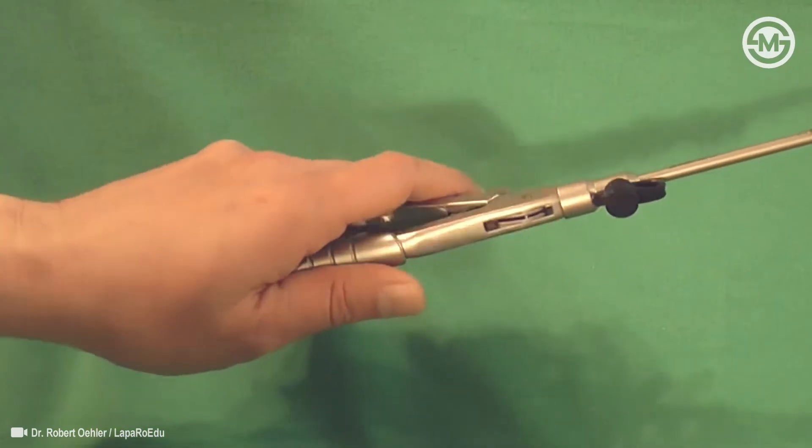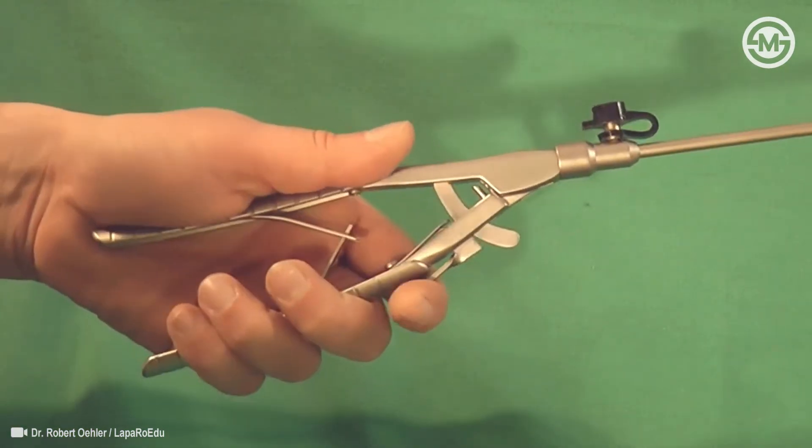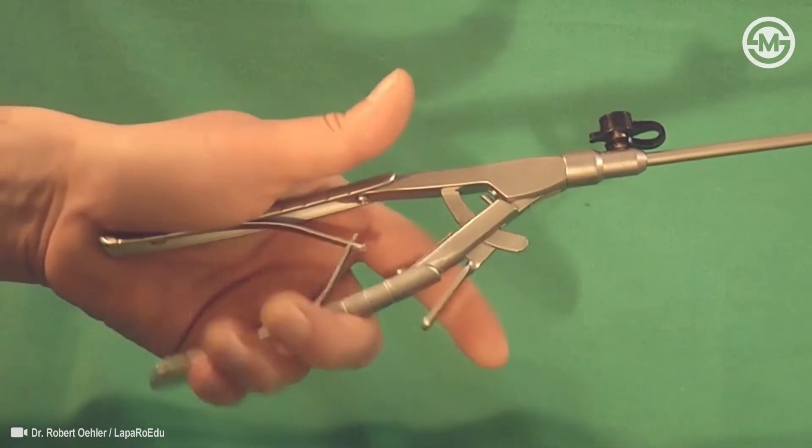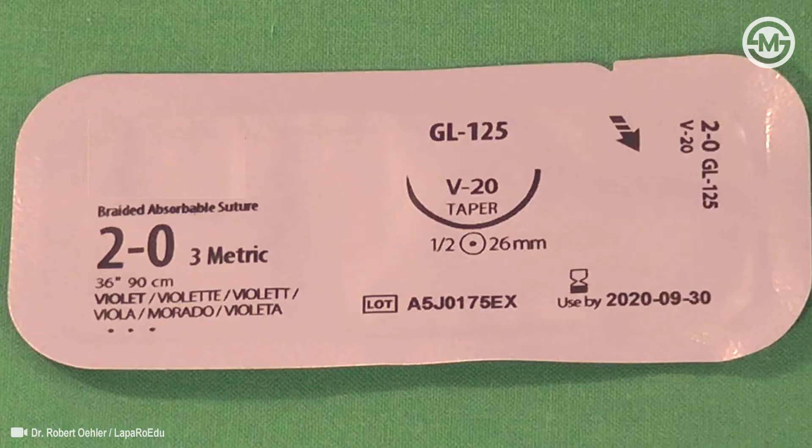This needle holder has a straight handle, which makes rotation easy. The index finger releases the grip. We use a 90cm absorbable braided suture for extracorporeal knot tying.